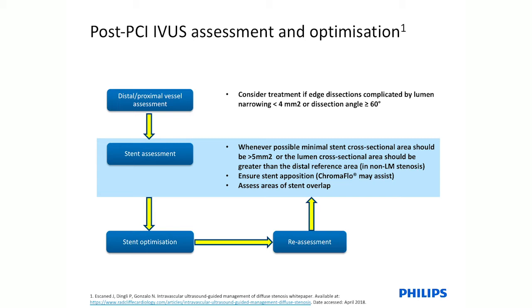Again, it is just a matter of choice or expertise to use concomitant techniques like StentBoost, which sometimes may indicate that the corrections you have made have been successful, and therefore in that case you may not require IVUS.